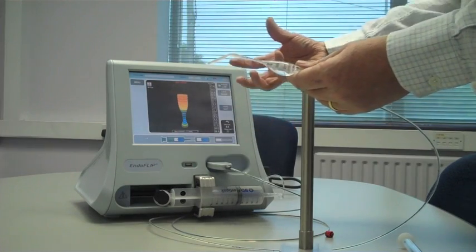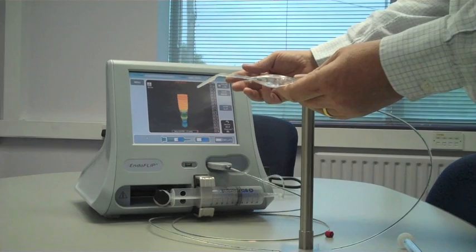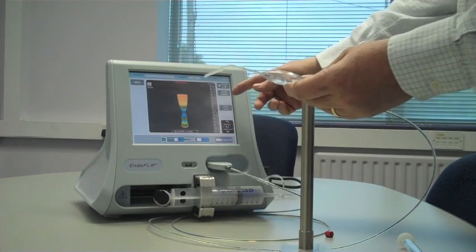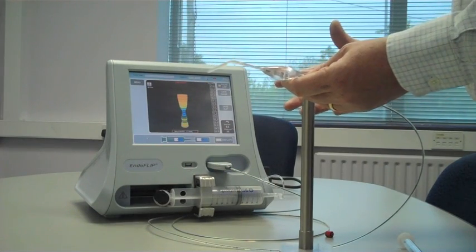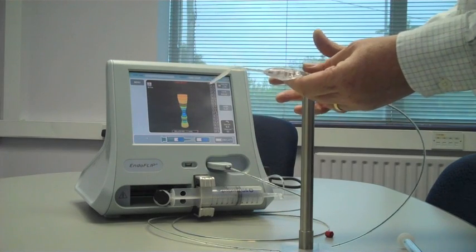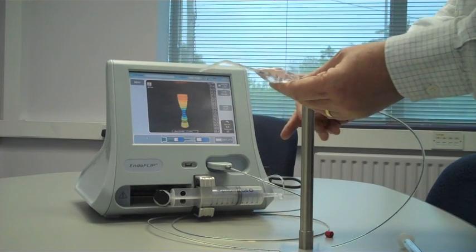This particular catheter has 16 electrodes, the one for lap band has 8 electrodes. But it's important that you center what you're measuring within the balloon, much like you would center a dilation balloon when doing a stricture dilation, for example.